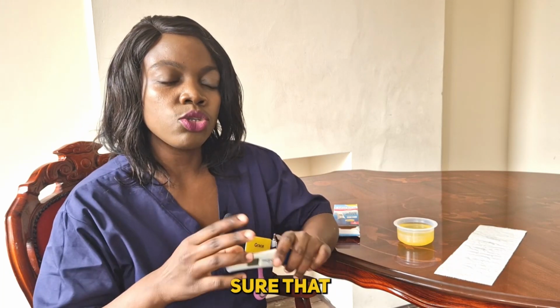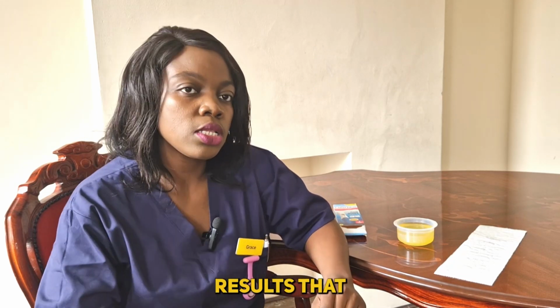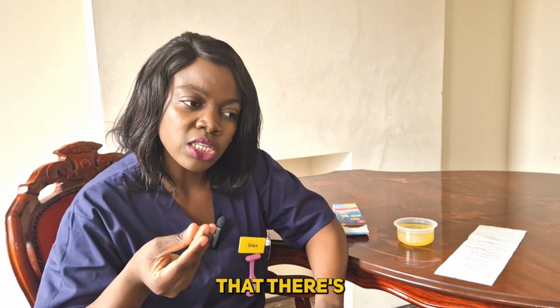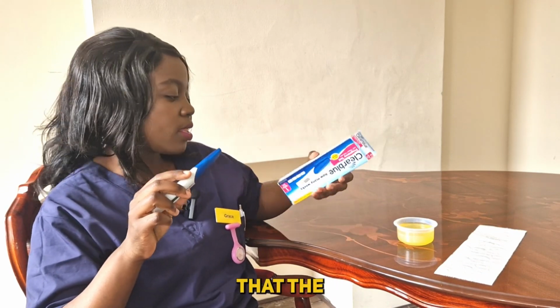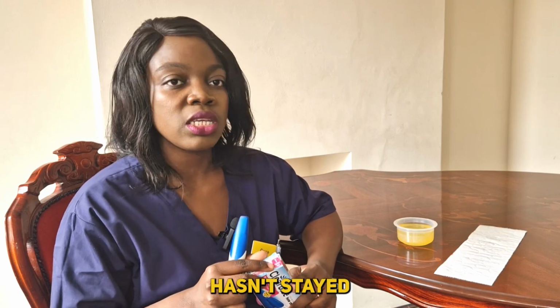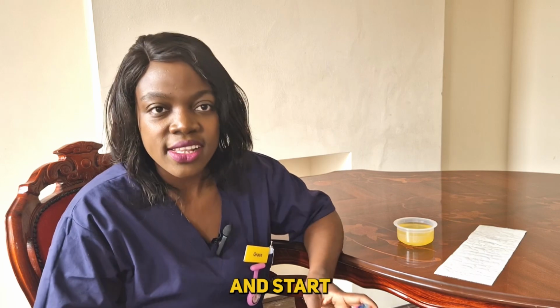When you buy your packet, make sure that it's not broken, because once air goes into the strip, then you're not going to get the results that you want, because the strip already absorbs a lot of water, and if it does, then the result you get is going to be invalid. So make sure that you see that there's no air inside the packet. Make sure you check on the expiry date. Make sure that the expiry date is not past. Like this one, you see it's 2025 January. So check the expiry, check when it was manufactured, maybe it hasn't stayed in the store for too long. Just make sure that you check a lot of things before you go ahead and start testing.